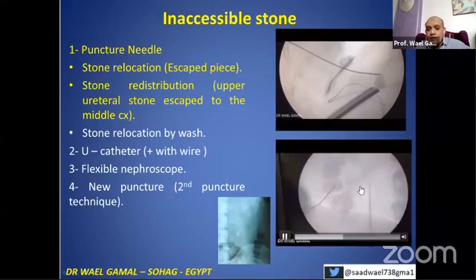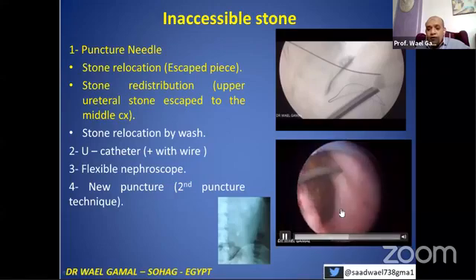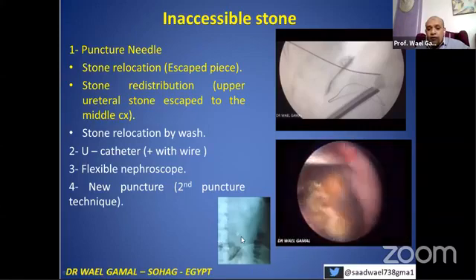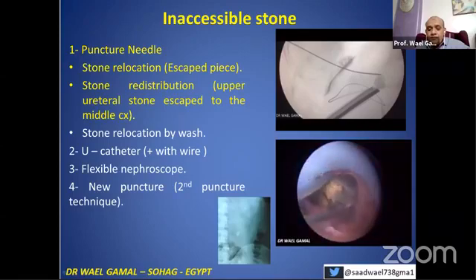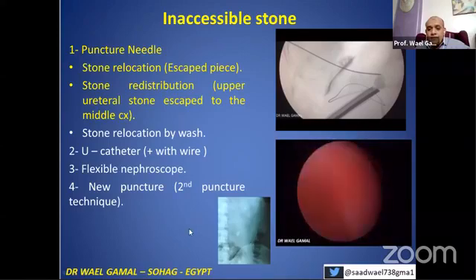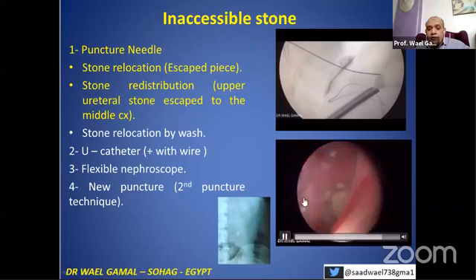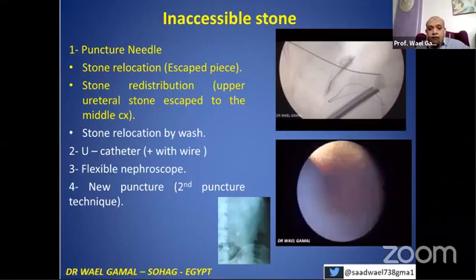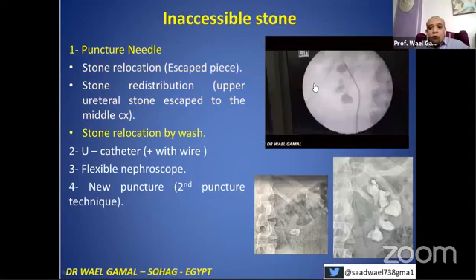This stone succeeded and escaped to the pelvis. Once you enter inside, you will find the first one — the pushed-back one — in the upper ureter. And this is the second one, which you pushed with your needle. You can also relocate the stone to the pelvis.